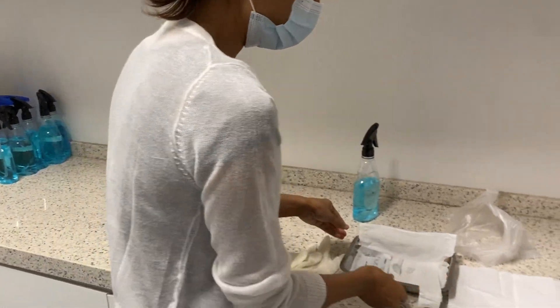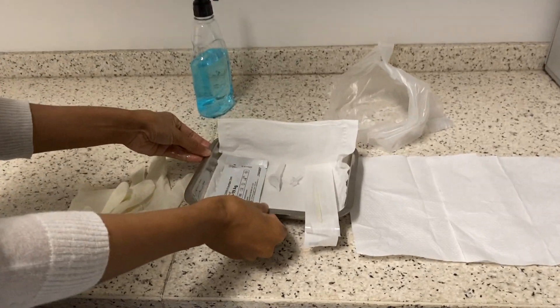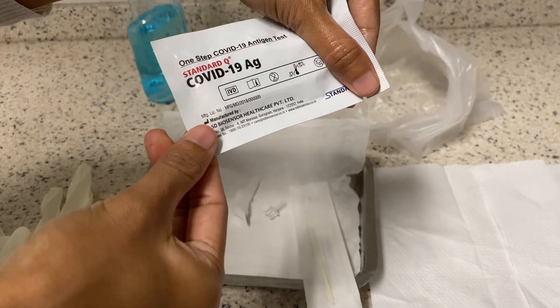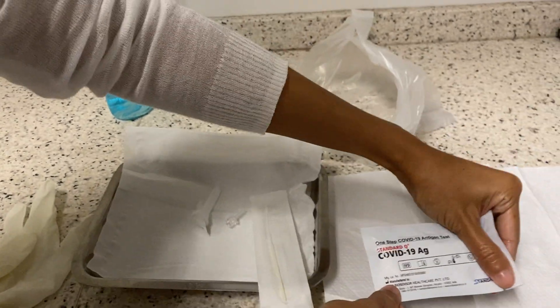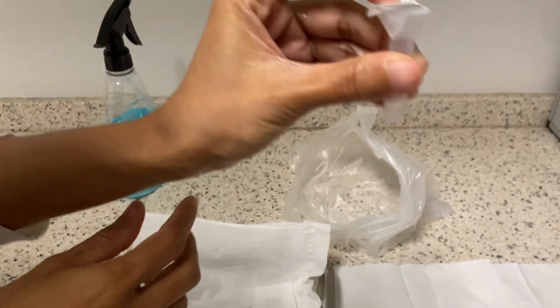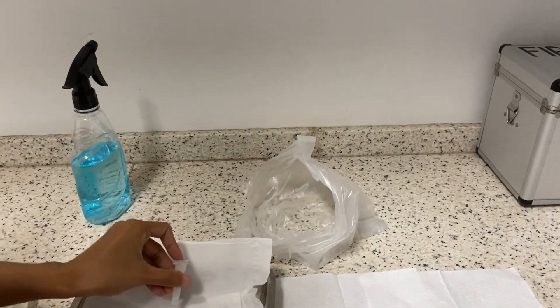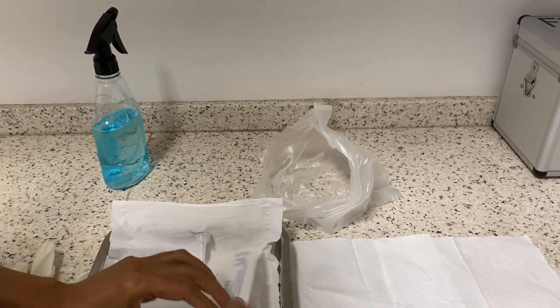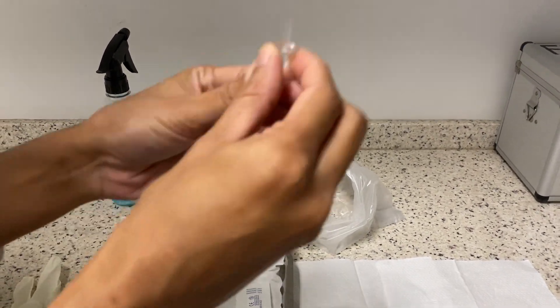And prepare the items. There are four items: the COVID-19 antigen cassette, a tube containing buffer solution, a sterile swab, and a cup.